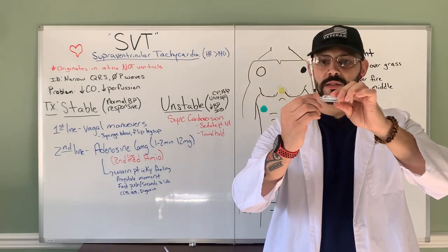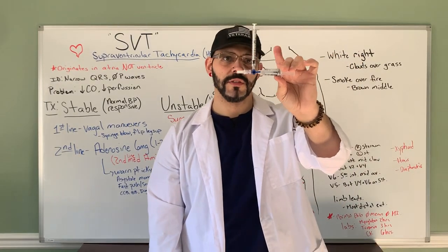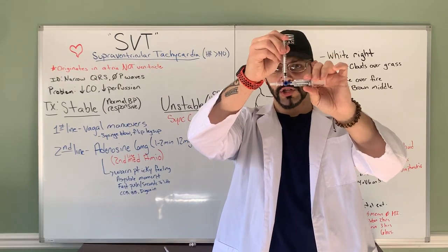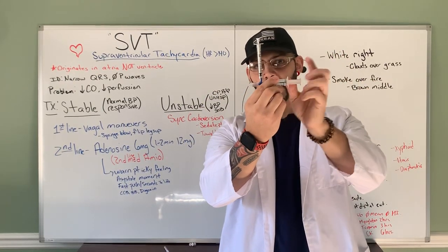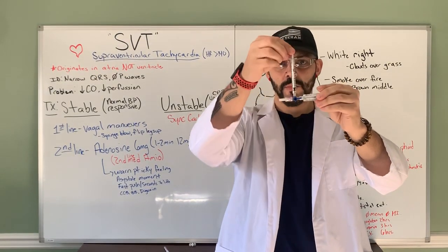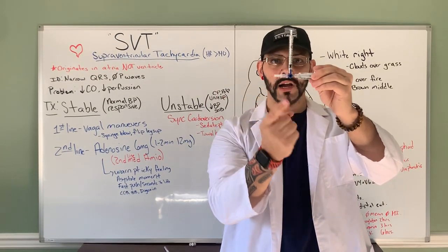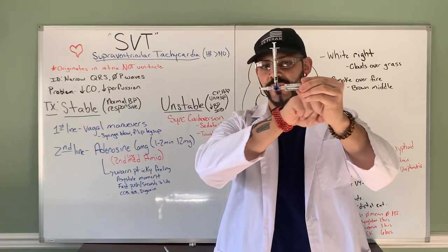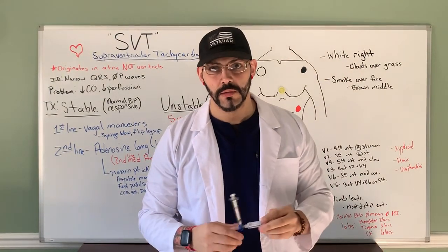Ensure that when you start, the lock is gonna be off to the syringe, off to the flush, all right? And then you're going to very rapidly push, turn quickly, flush. So again, you're gonna start off with it off to the flush. You're going to quickly administer the adenosine, quickly turn the lock, so you turn this off, and bolus this little syringe here. Flush it very hard, okay? Because it has to reach the heart before it loses its potency, okay?